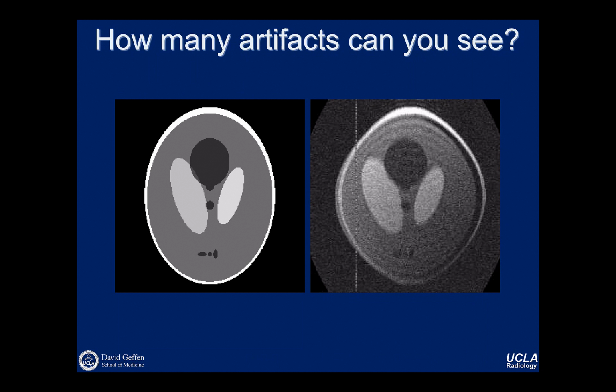Gibbs ringing artifacts happen in the phase encoding direction, which is our lower spatial resolution dimension, and we have a really high contrast boundary. A motion artifact, if we just went back like 6 or 8 slides, could look a little bit like this. Typically, you'd have the concentric artifact. The artifact would be concentric over larger parts of the object, and you would see it throughout the object as well. So sorry if I didn't pick up on that exactly that way.